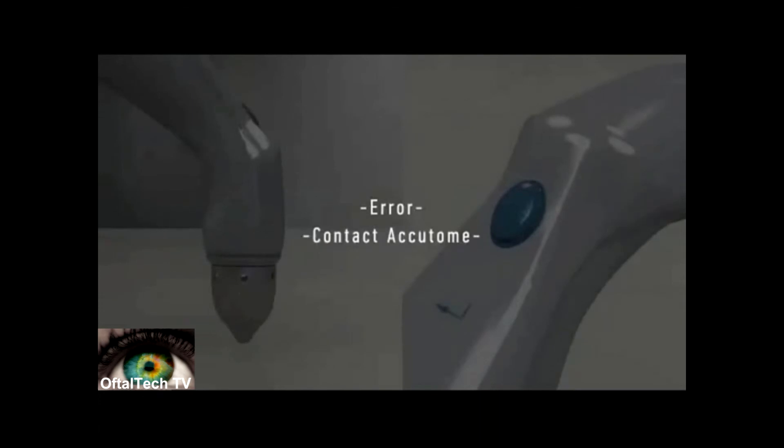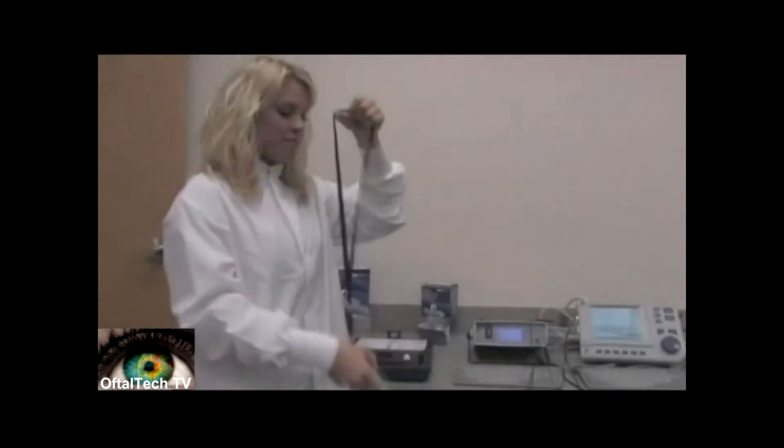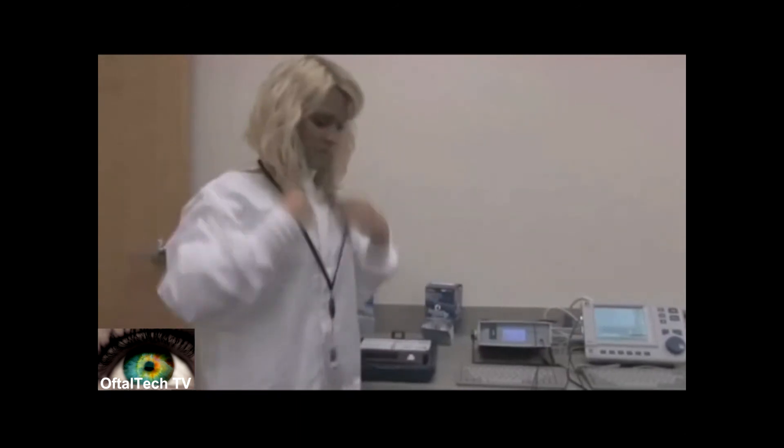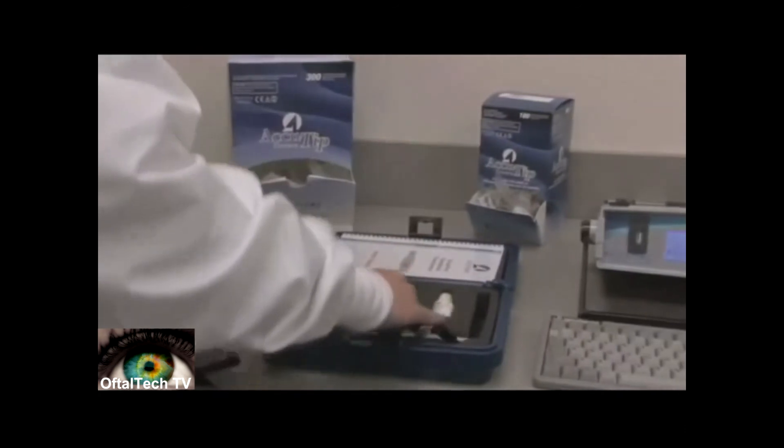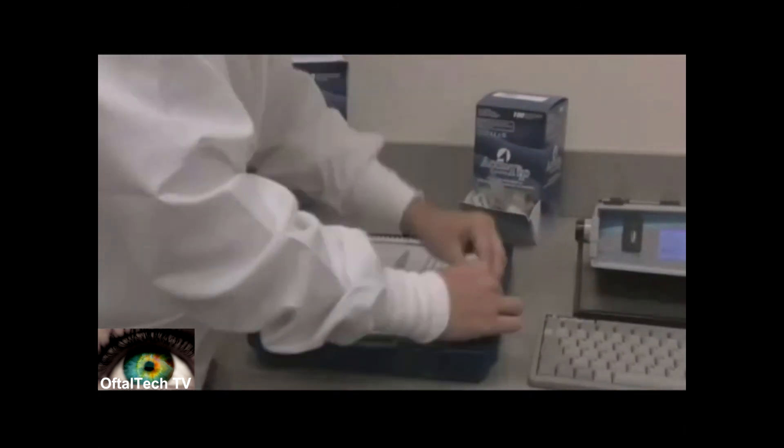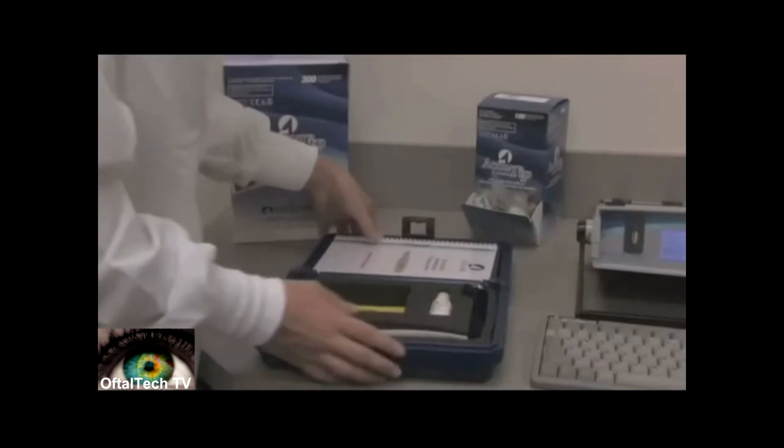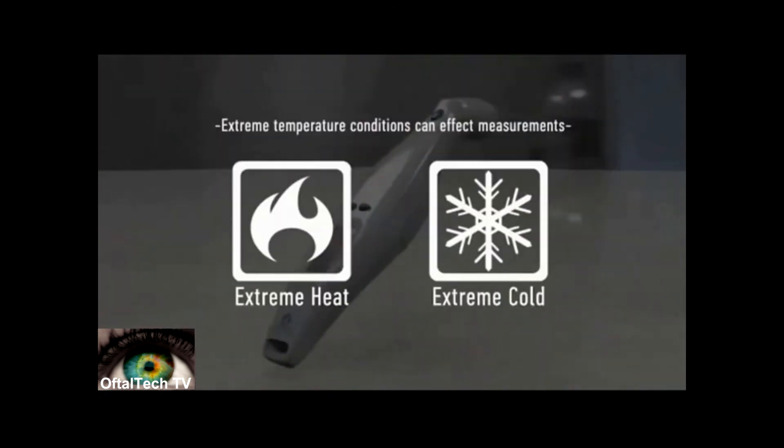Other helpful tips include grasping the lanyard at all times to prevent your AccuPen from dropping. It is also important to store your AccuPen in its proper case when not in use. Please keep your AccuPen out of extreme temperature conditions. Extreme temperature conditions can affect measurements.